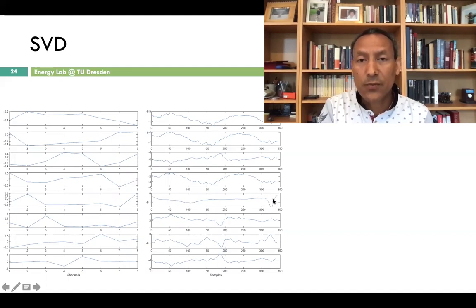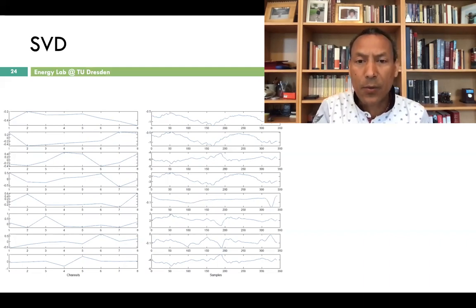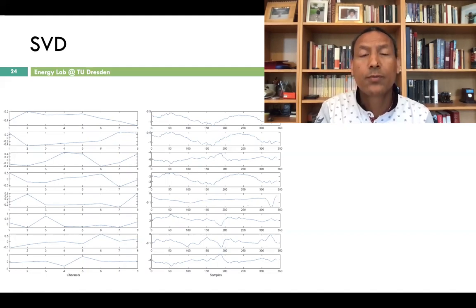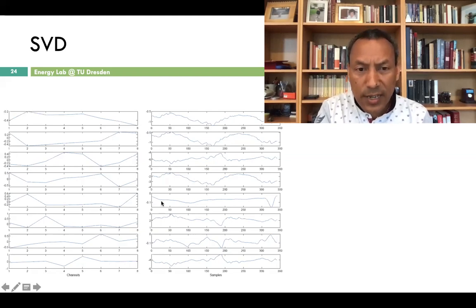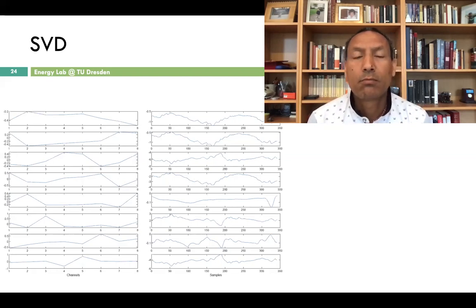Here you can see that it is flipped, but you see that this is a proper ECG signal, with the QRS complex here, flipped, the T wave around this area, and the P wave around this area. The P wave usually disappears when the person moves, even in the absence of motion artifacts, so we can leave it. But otherwise, you can see that it's a clean signal. All the others we can consider as motion artifacts or noise from wherever they come from. We don't care.